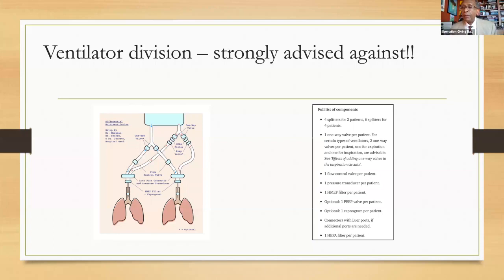Thank you. There are a few questions that are definitely repetitive. Number one, Dr. Elias just mentioned quick weaning, but there was a question from the audience whether the weaning protocol is any different from other respiratory failure patients. Would you be more cautious in these patients, since you don't want to risk re-intubation because you re-expose everybody? Or is the weaning protocol the same as in any other intubated medical pulmonary patient? How do you practice?